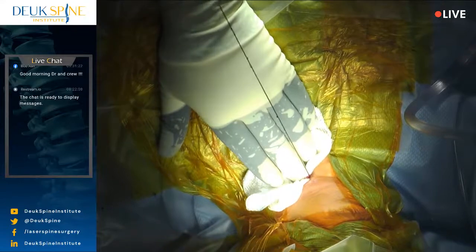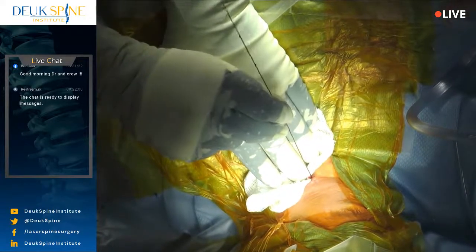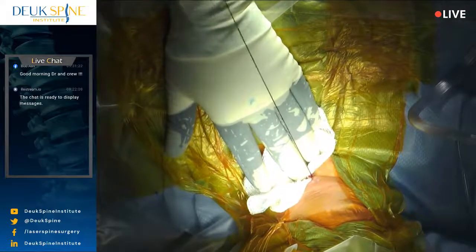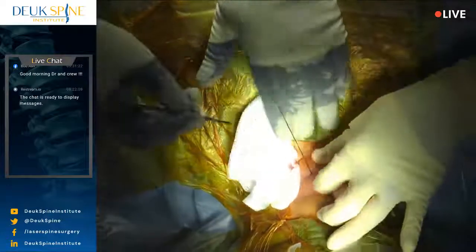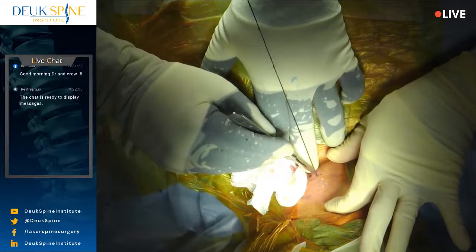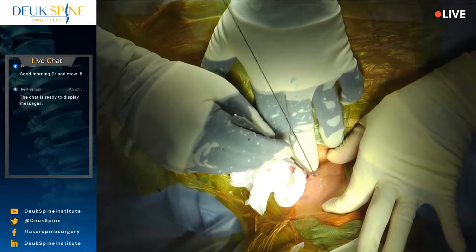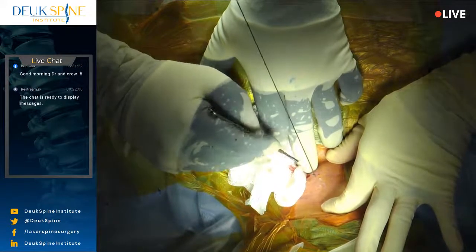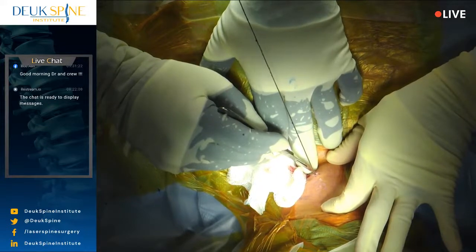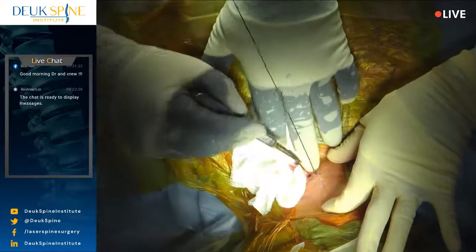And to place the guide wire properly, you have to have reliable information. You know, reliable landmarks, okay? Every guide uses landmarks and knowledge and experience. And so this is no different in spine surgery when you're doing minimally invasive endoscopic surgery. We need landmarks. And the landmarks I use during the fluoro is the spinal anatomy, the vertebrae, the discs on AP view and lateral view.